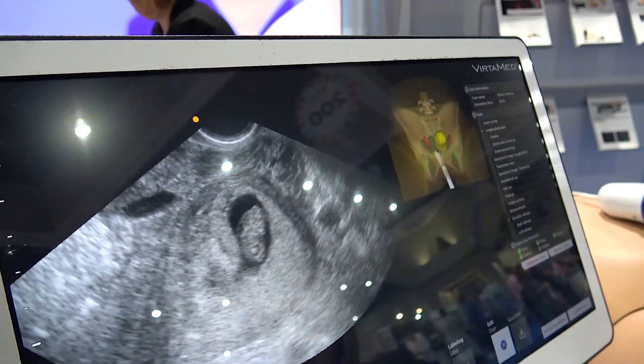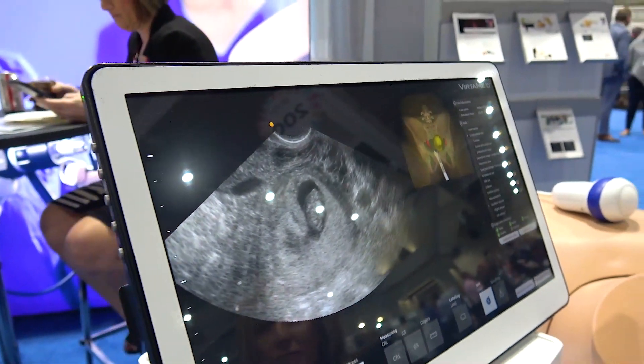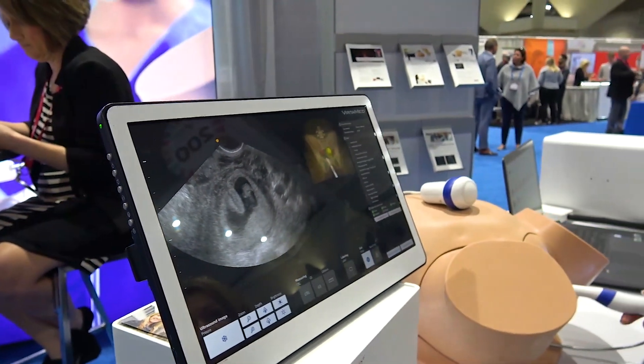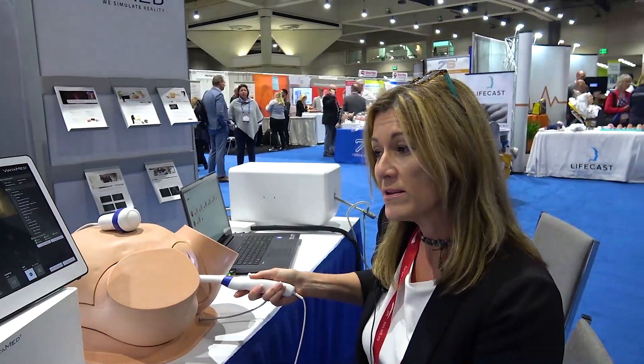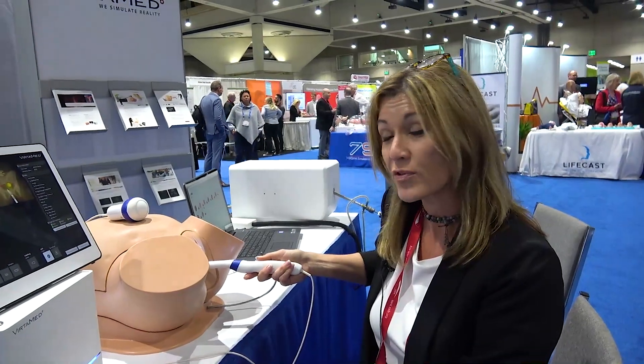This will allow a sonographer to practice recognizing the signs of an abnormal pregnancy so that they can progress through the pregnancy and document the pregnancy for the doctor.